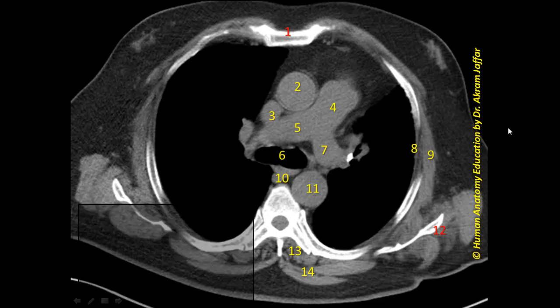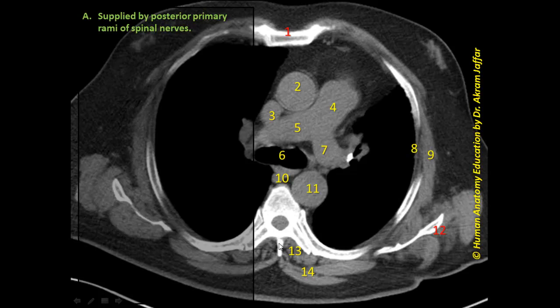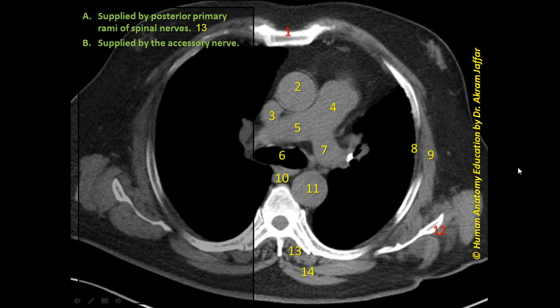Let's now check the options. The first phrase: 'supplied by posterior primary rami of spinal nerves.' This phrase is related to a muscle located around the thoracic wall. Posterior primary rami supply the true muscles of the back — the erector spinae muscles. It is structure 13, the erector spinae muscle, because 14 is a more superficial muscle, the trapezius muscle, which is not supplied by posterior primary rami but by the accessory nerve.